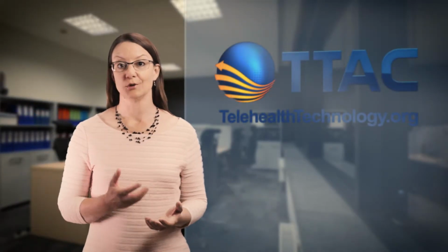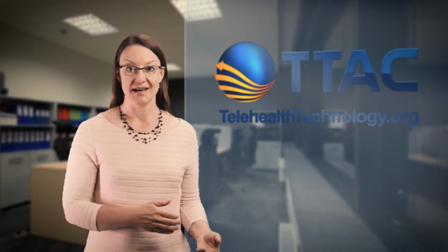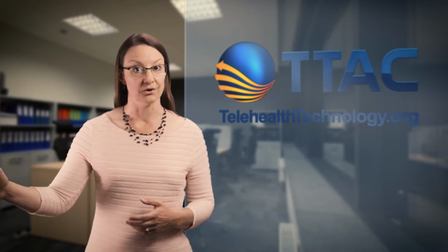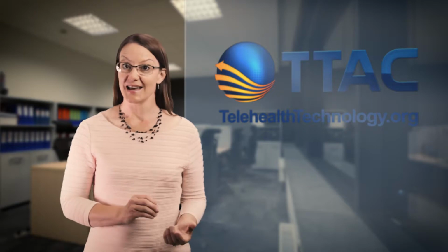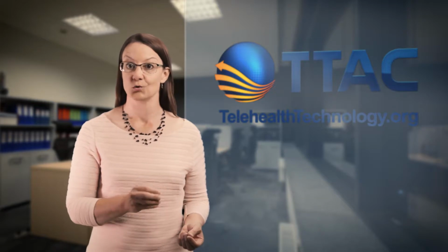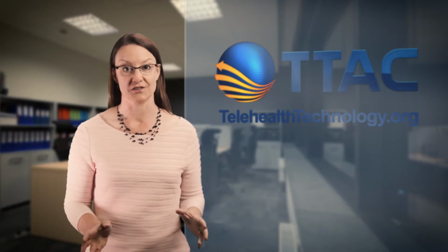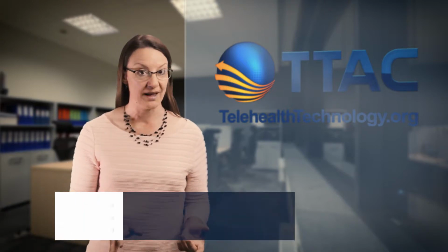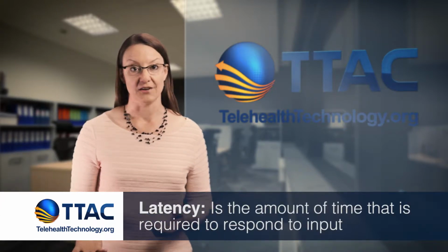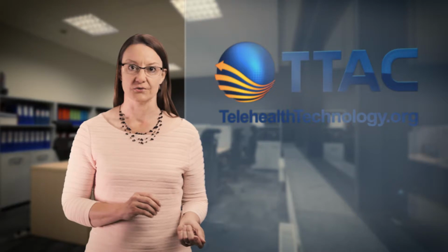Out-of-band software makes the workflow for the televisit more complex than the plug-and-play simplicity of in-band stethoscopes, as it requires logging into a separate application, finding the appropriate provider or remote computer, and requesting a connection. That said, many providers are willing to deal with such extra steps in exchange for greater confidence in the sound quality. Our lab has tested some of these out-of-band solutions on absolutely horrendous connections with dropped packets, high latency, and low bandwidth, and found that they worked very well. And notably, when these systems did fail, the audio was typically so garbled and distorted that it was clear that we were experiencing connectivity issues.